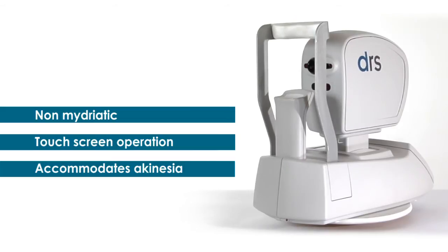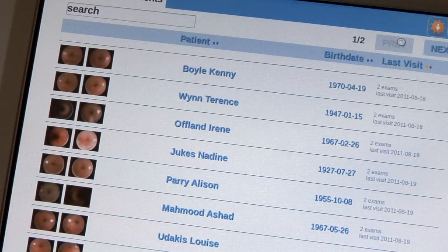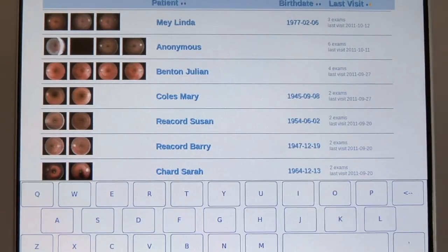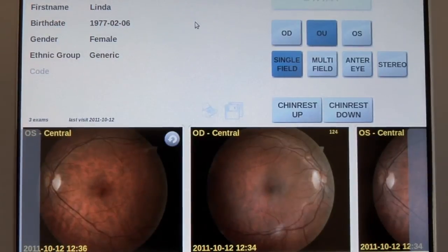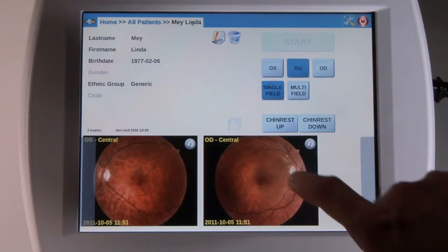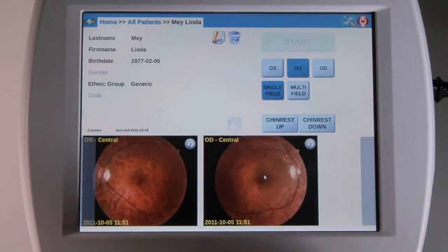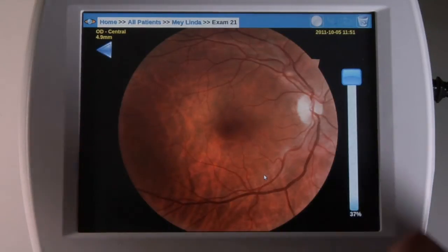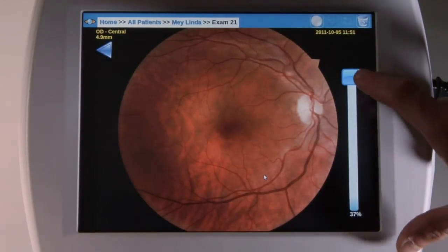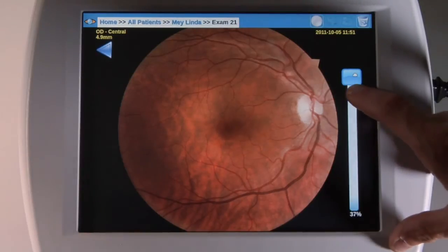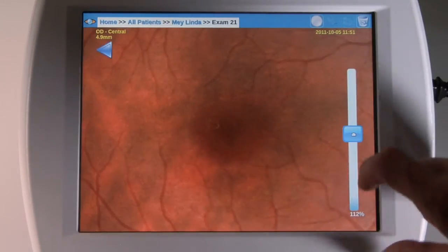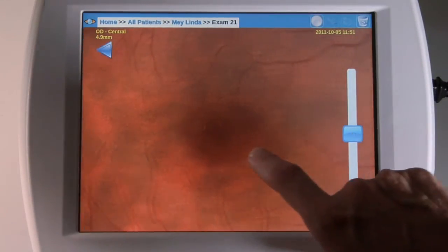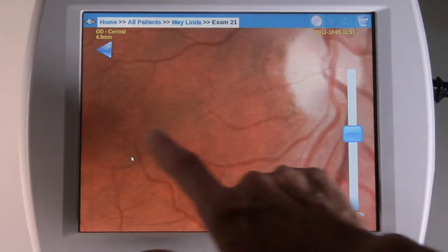For returning patients, you can simply input the patient's name and the DRS will recognize the patient's profile and will help you navigate through her or his history. It will also automatically add the new data to the patient's profile for future reference.